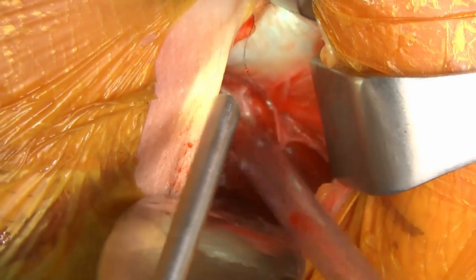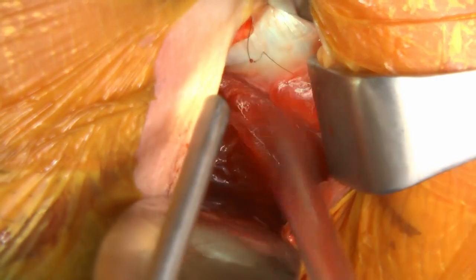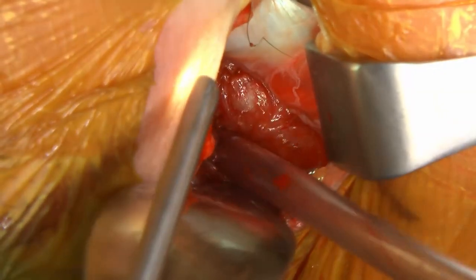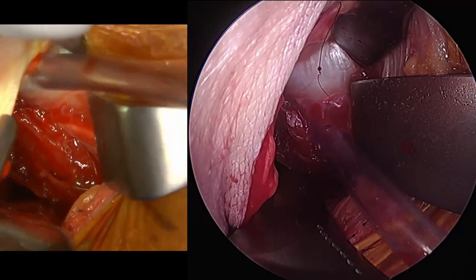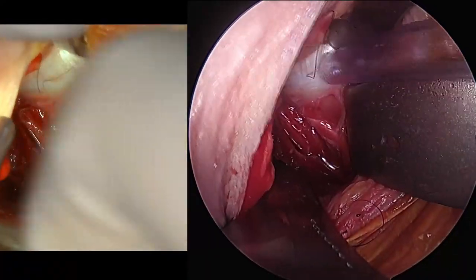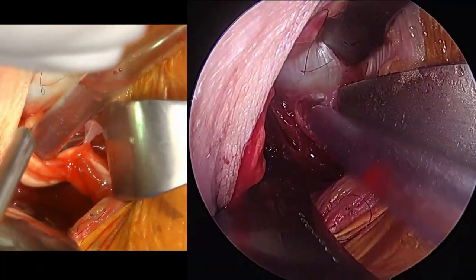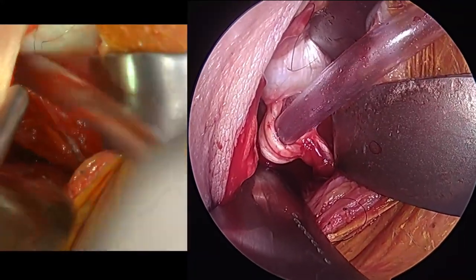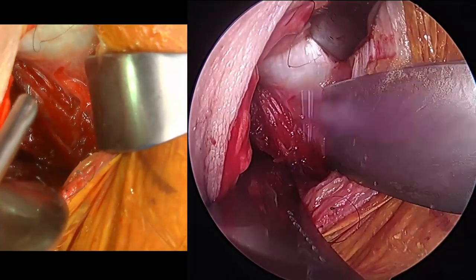So this is the pec tendon right here. This is the bicipital groove. And then this is the short head being pulled over. The biceps is in a bit of a sheath that's connected to the pec right here. As you can see as I pull on that, there's the biceps right here. That's our biceps tendon. It's right next to the pec, but here there's almost like a split sheath over the top of it. So we'll take the hemostat.